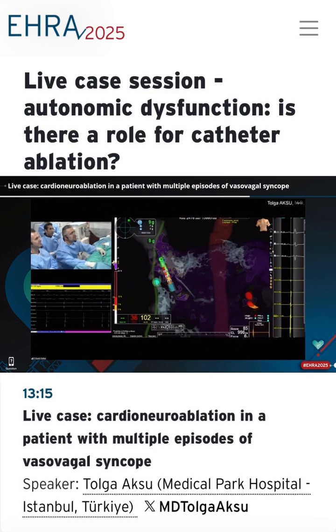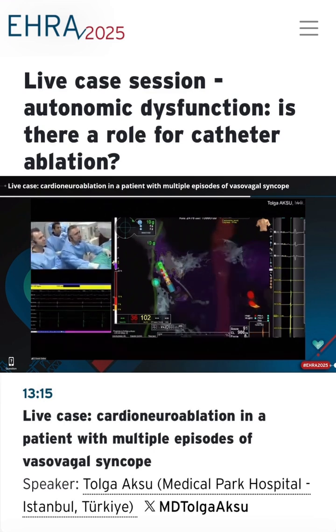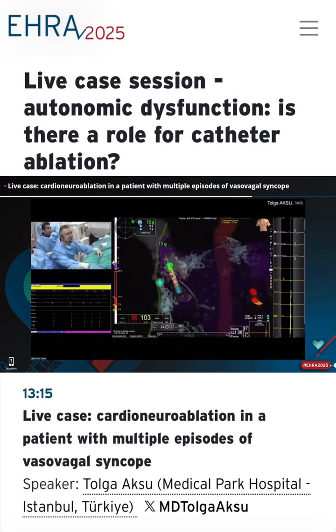Yes. Our CT map shows the same area here. And please look at the electrogram on the left panel. You are seeing clear fragmentation. Heart rate is 60 BPM and I will start the ablation. We already checked the phrenic nerve and, as you see on CT, it's far from our ablation area. So I will start the ablation. Heart rate is 57 or 60 BPM level.